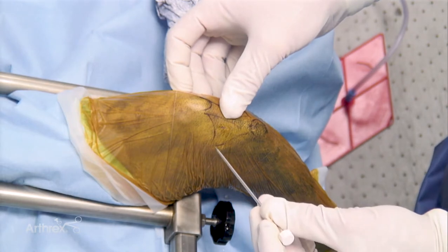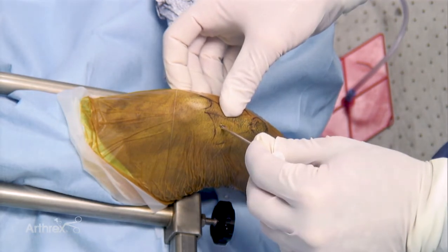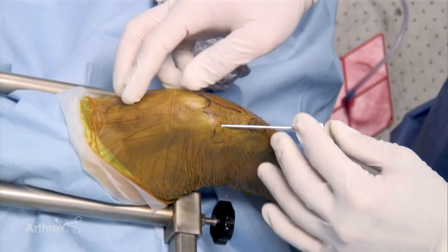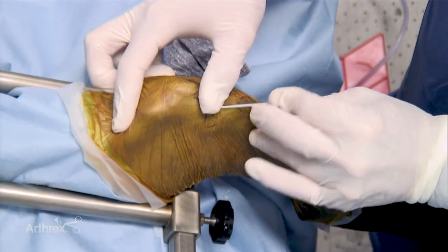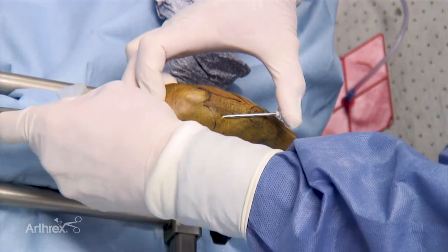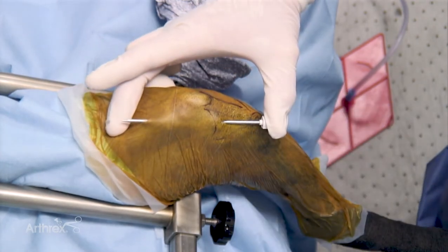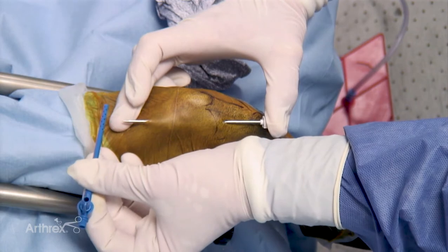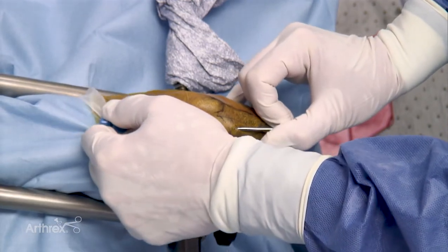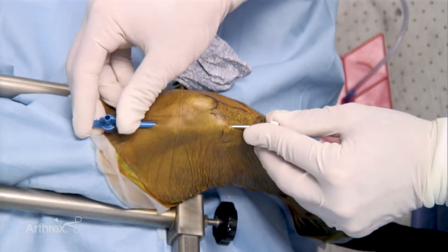The next step is to place an ingress-egress cannula. The 2.7 blunt flow cannula is preferred. The obturator is placed to the joint level and then moved gently around the femoral condyle until it can be run up the medial joint space. It is then pushed through the soft tissue until it becomes apparent at the skin level. An 11 blade is used to cut down upon that obturator until it can be inserted through the soft tissue. The fenestrated flow cannula with its associated stopcock is then placed from proximal to distal, threaded over the obturator, and becomes apparent at the port site.